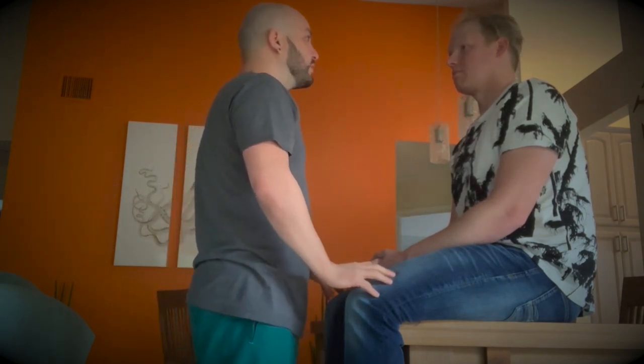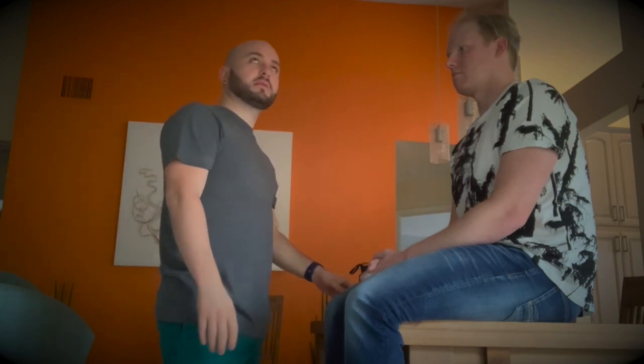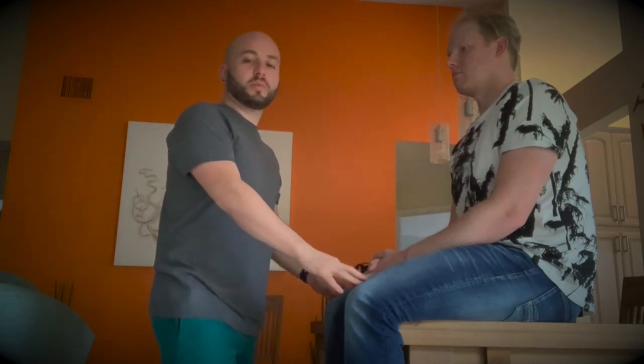The next thing we will do is a Snellen visual acuity test. We will place the patient 20 feet from the board and then assess their visual acuity. If it would be 20 over 60, that means the patient is able to see at 20 feet what a normal person would see at 60 feet.